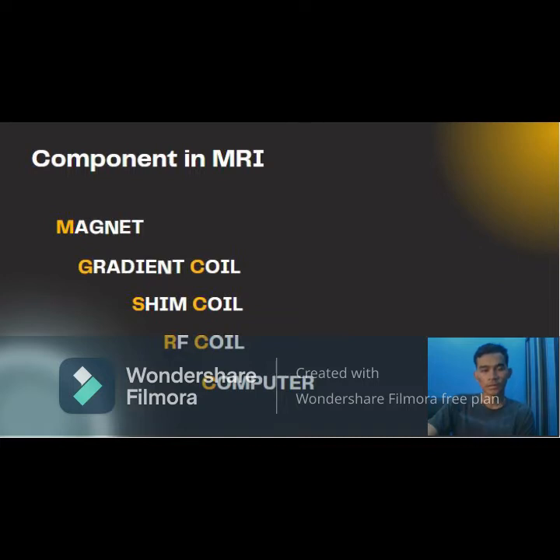The magnet's function: the biggest and most important component of an MRI system is the magnet. We are dealing with an incredibly strong system here, one capable of producing a large, stable magnetic field. There are several different types of magnets that can be used to produce the magnetic field. Each has its advantages and disadvantages.